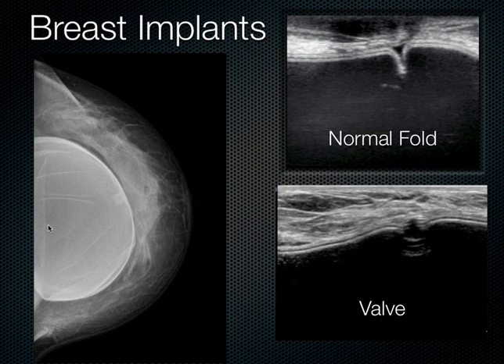Because I don't really do mammograms as an emergency physician, but I do a lot of breast ultrasounds, especially with implant problems. And now that I see this on the mammogram, it makes me realize why I was seeing these folds here. Also, it looks like there's a discontinuity of this one here, but this is just a normal valve.